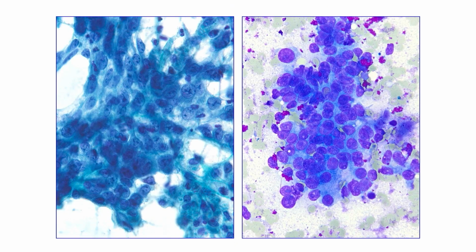So this is the highest magnification I could show you. Again, nesting of the cells. Nesting means they are true tissue fragments forming an architecture. Large nuclei, open chromatin, macronucleoli. In this case, suggestion of gland formation or at least some rosetting of the cells. You can see open chromatin, macronucleoli, some lymphocytes in the background, syncytium because the cell boundaries fuse together, creating this jumbled up mass.